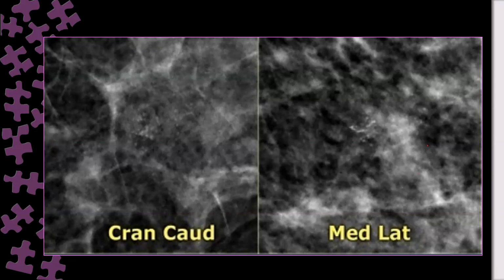It is there is spot magnification. Yes, you are right. Cluster of microcalcification. Excellent, but cluster, they obsolete terminology. According to them, they change. From time to time they usually change their terminology and ask us not to mention the old one. Please go to the new one.